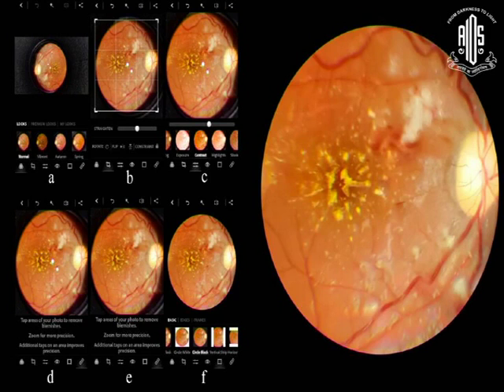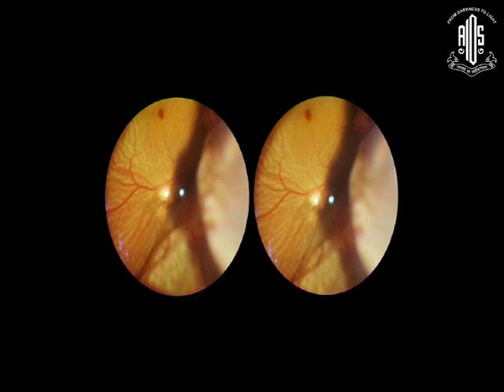And every fundus imaging software has a black mask which comes on it to make it look impressive. You can apply that black mask on Photoshop itself, and when you look at this image, it is indistinguishable from that taken from a conventional camera. It looks just like a normal fundus picture taken with a camera. And you can take stereo pictures, as I told you earlier also.